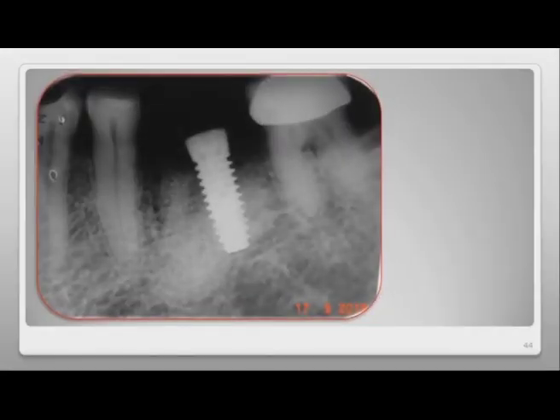For this, the most important thing, and this is probably critical, is the date. September. A while ago I said 2016. Sorry, I made a mistake. Let's confirm. Here, this X-ray was taken in September 2015. The implant placed in this site where the patient's bone replaced the material.